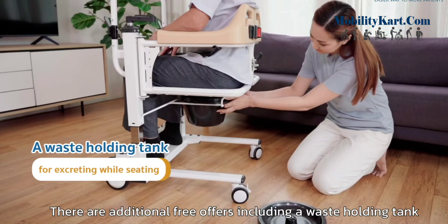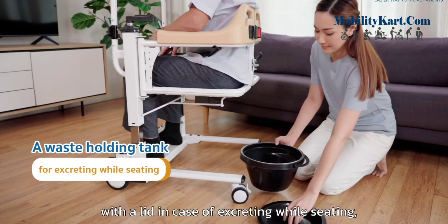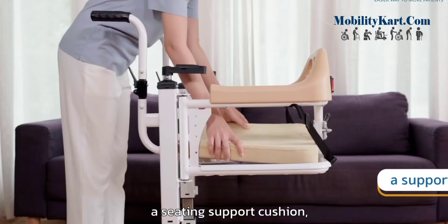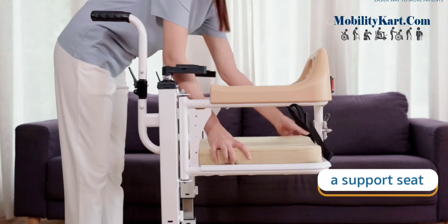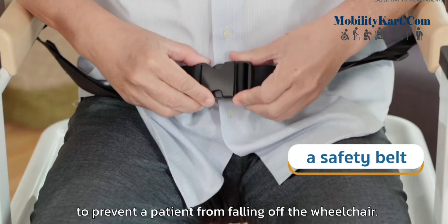There are additional free offers including a waste holding tank with a lid in case of excreting while seated, a seating support cushion, and a safety belt to prevent a patient from falling off the wheelchair.